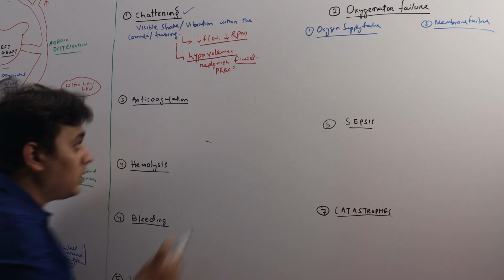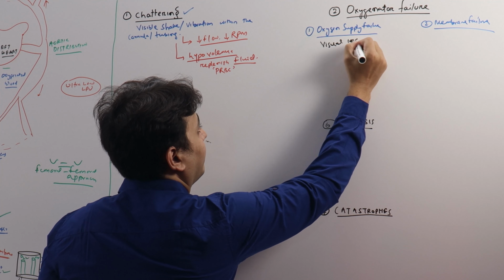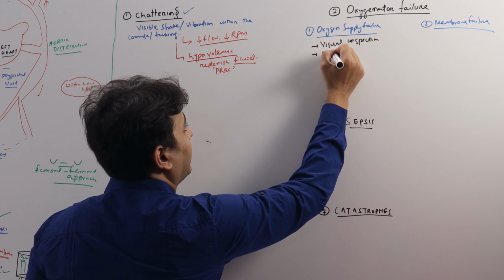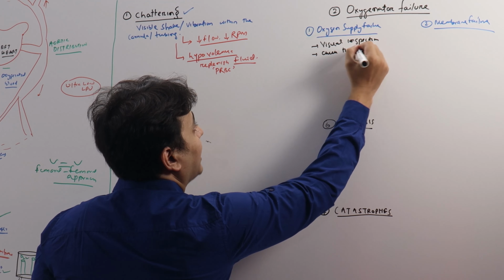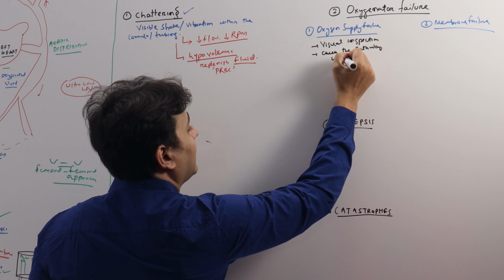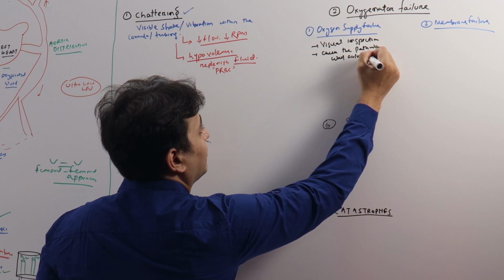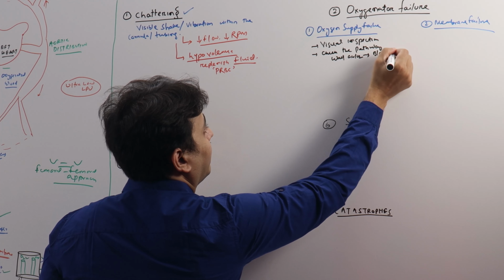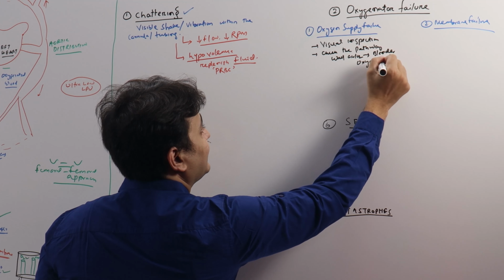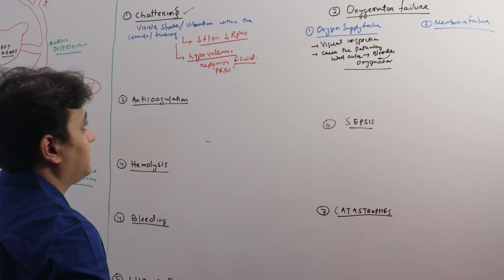So visual inspection is very important here. Then you have to check the pathway. What is the pathway? Wall, air and oxygen, from there to the blender, from there to the oxygenator. You check whether this pathway is working or not, or if there is any problem in any place, right?